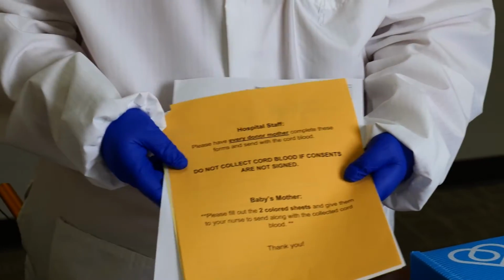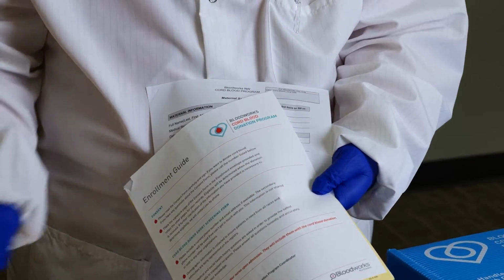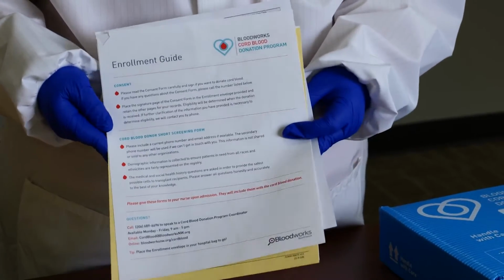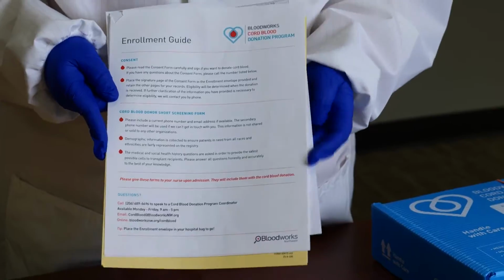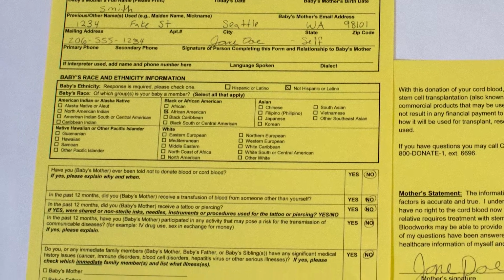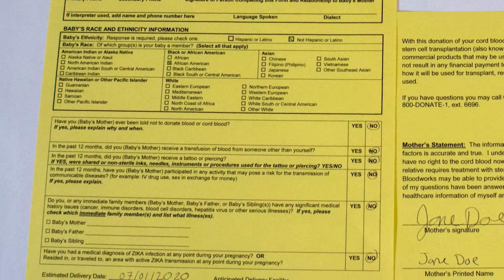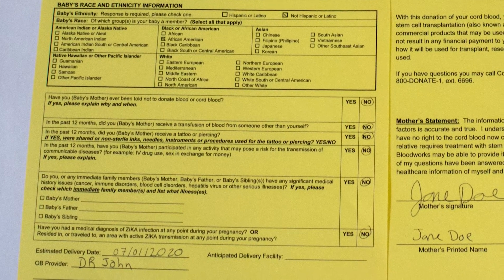The next forms in the packet are for the patients. This includes information about cord blood collection and what the patient will need to be filling out. There's a short screening form that the patient will complete with some information about their demographics, address, and anything that might make them ineligible for donating cord blood, such as travel restrictions or family medical history.